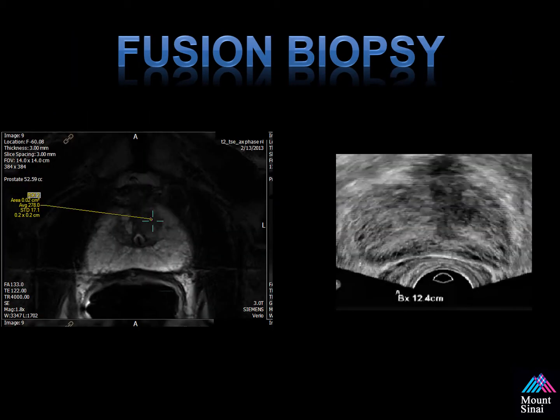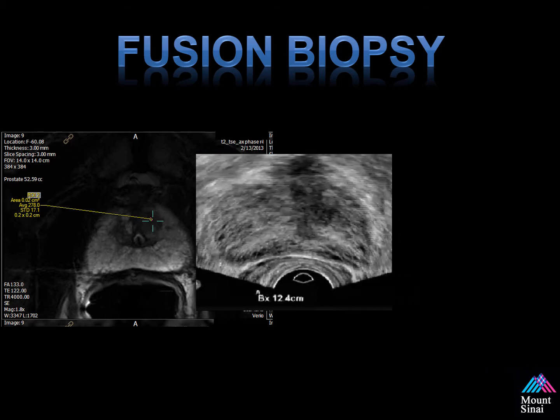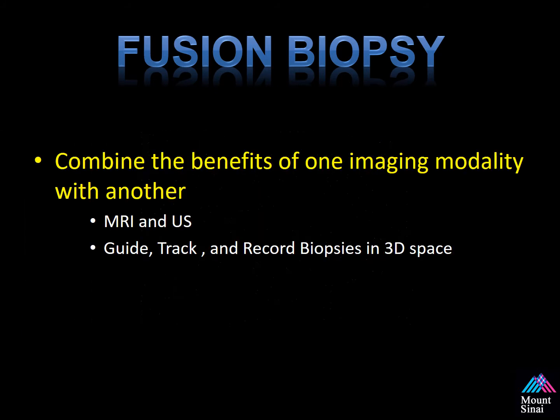This is an example of fusion biopsy. On the right side of the screen, you see an ultrasound of the patient's prostate. On the left is the high-resolution T2 image, which we use to surface render and target during the procedure. Fusion biopsy and fusion imaging essentially combine the two data sets together, allowing us to take the benefits of two different modalities. MRI has high sensitivity and specificity for identifying lesions within the prostate, while ultrasound is relatively inexpensive and available in most doctors' offices. When we combine the two, we're able to guide, track, and record biopsies in 3D space and correlate with MR images.